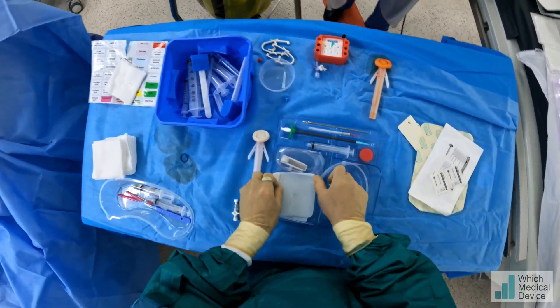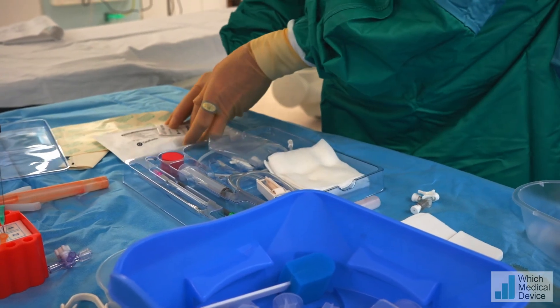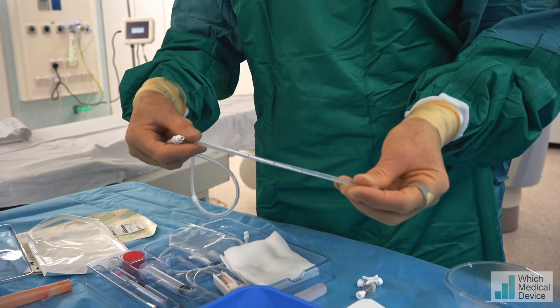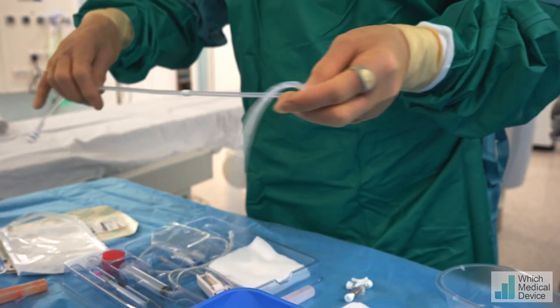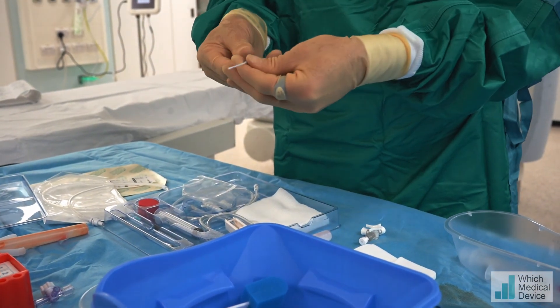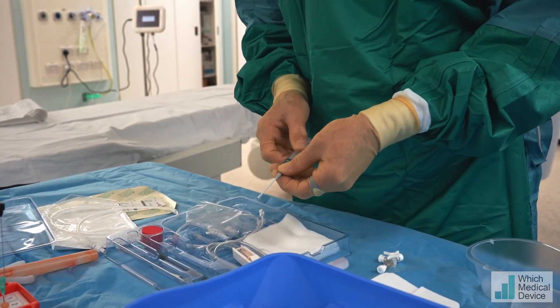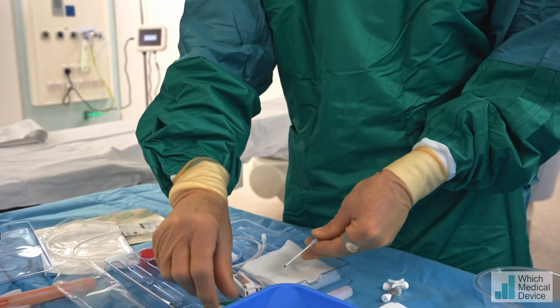Now we're going to take the Pleurex drain. The actual Pleurex drain is in this packet here — it's just like a thick Hickman line with a valve on the end, multiple side holes along the tube, and a cuff which is going to sit about halfway along our tunnel. We need to make our puncture — this is a little bit like a Seldinger needle; it's got a plastic sheath over the outside, a bit like a Venflon. We're going to pop that in, aspirate, and put a guidewire in. Once we've done that, we'll make our tunnel and then use the peel-away sheath to place the actual drain.